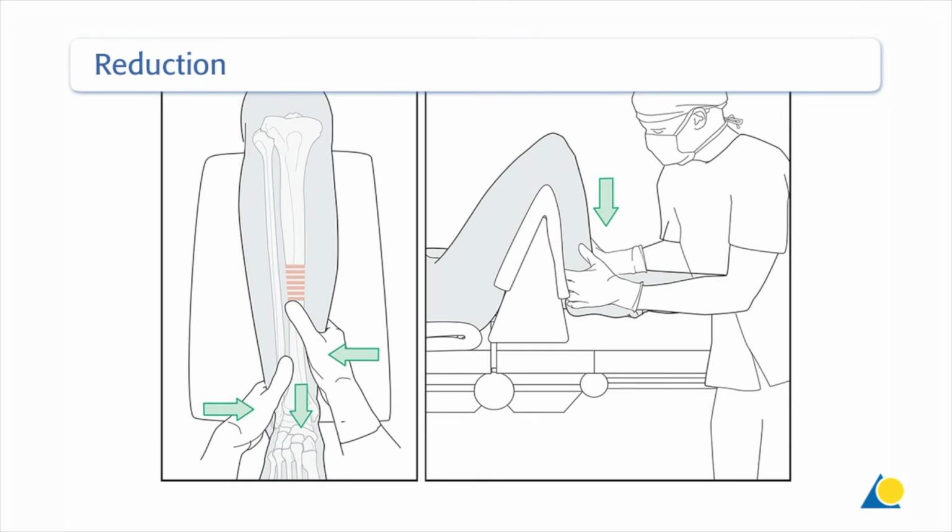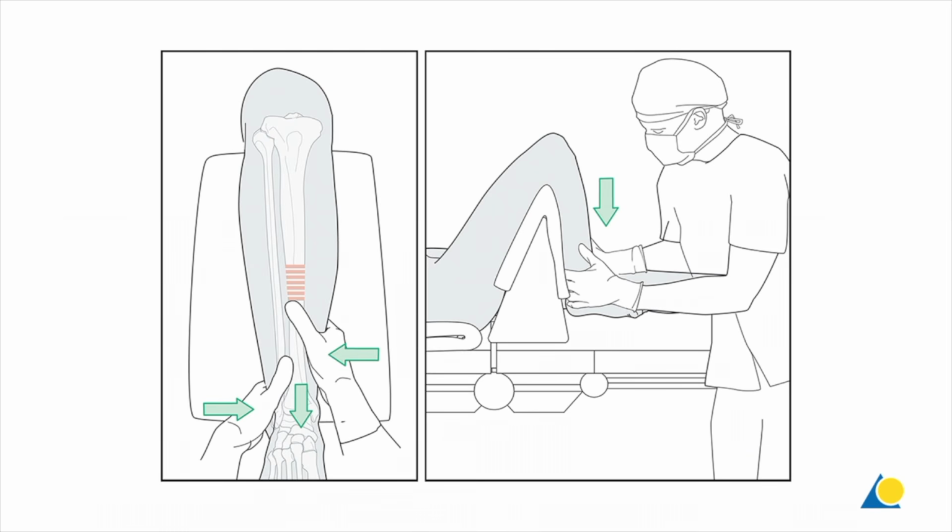Reduction is an essential part of intramedullary nailing. The fracture must be reduced to allow both guide wire placement during reaming and nail insertion. It is important that length, angulation, and rotation are all restored. Additional correction of alignment may be needed even after guide wire insertion to avoid deformity. This should be performed before reaming and nail insertion.